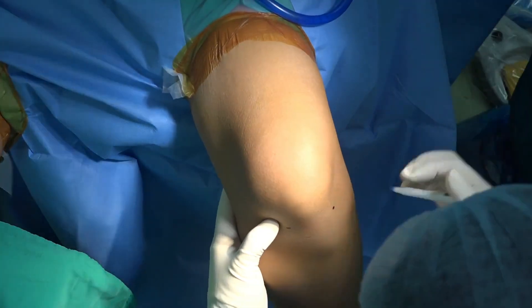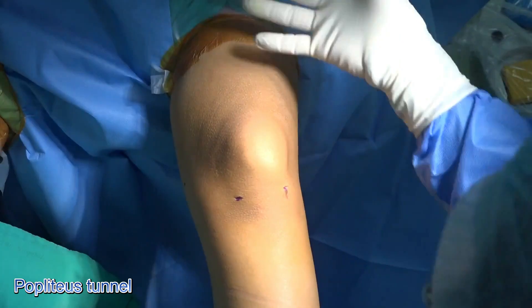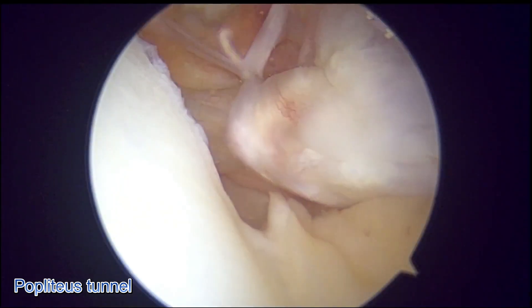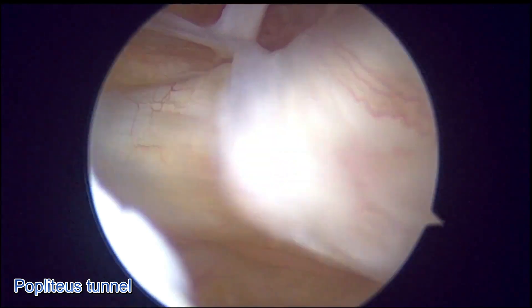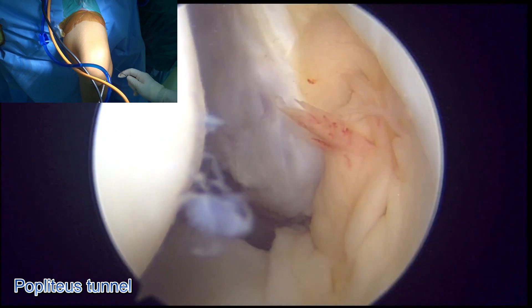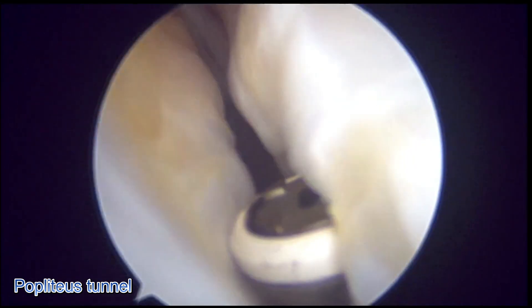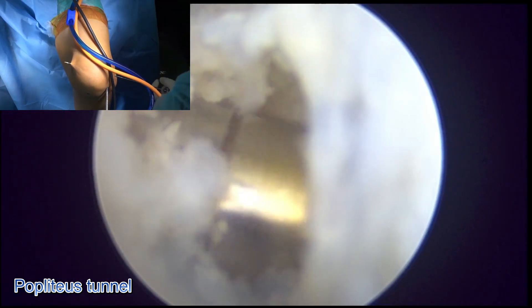We begin by mounting the anterior medial and the anterior lateral portal. The torn popliteus tendon can be seen here at the posterior lateral corner of the knee. A portal is created on the lateral gutter in order to approach the femoral attachment side of the popliteus tendon. The tunnel is aimed upwards to avoid drilling into the notch.